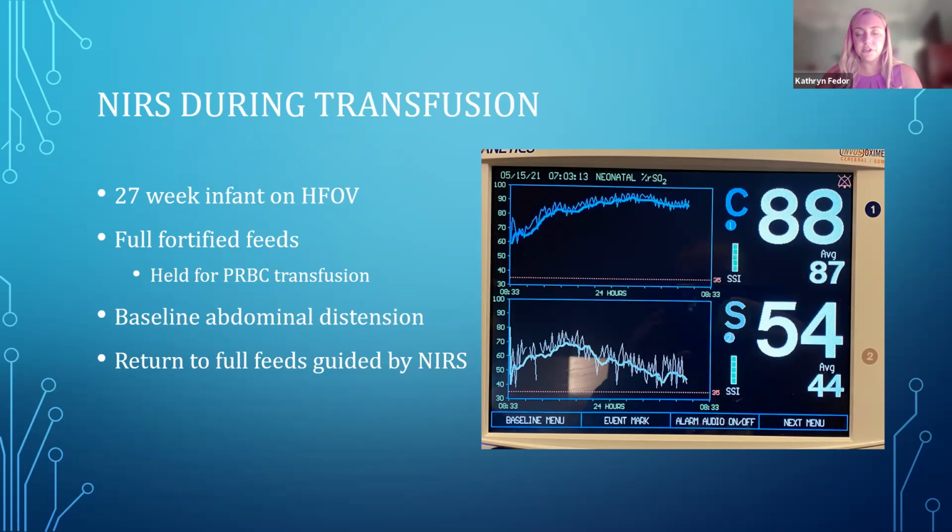We waited an additional 3 hours to return to feedings, and then the baby was started at half volume for a few feeds and then advanced to full volume, and the baby did quite well. Never developed any issues. But this is a baby that we like to think we prevented something potentially more devastating, like a gut injury. Even though we didn't see a whole lot of babies that had this response, it was reassuring when we did see some of the things that we had read about in the literature.